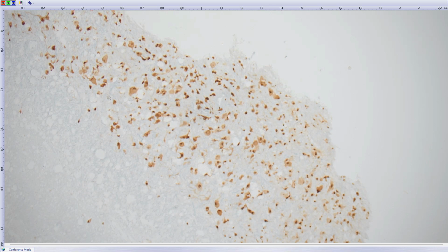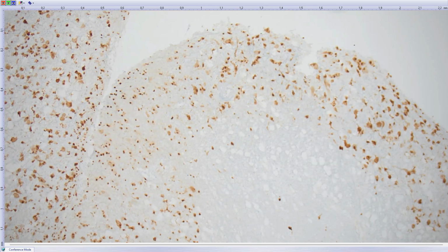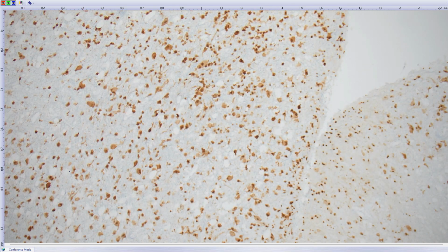So most of the patients are asymptomatic. They have the lesion, but the symptoms come from other organs, not from the brain lesion. So that's why we as neuropathologists don't see these lesions very frequently. And this is probably my 5th or 6th case only I've ever seen. So dysplastic gangliocytoma of cerebellum was my first case.